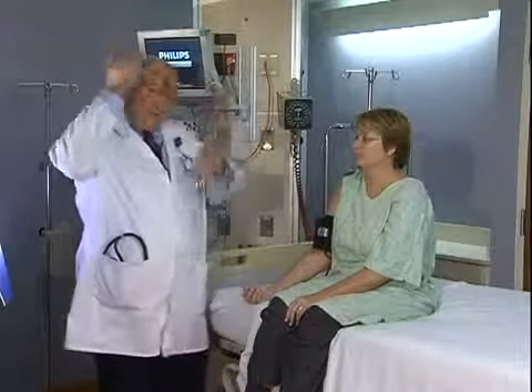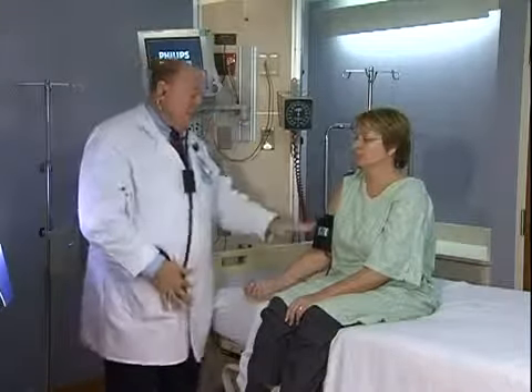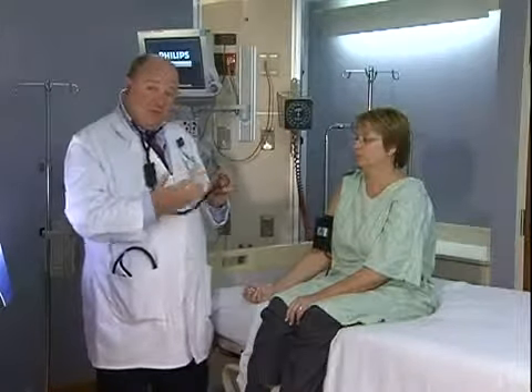Let's demonstrate how to simulate a very high blood pressure on an otherwise normotensive patient. You'll notice that the blood pressure cuff is completely standard, including the dial. The only thing that will change is the start and stop of the Korotkoff sounds in my stethoscope, thanks to the ventriloscope.